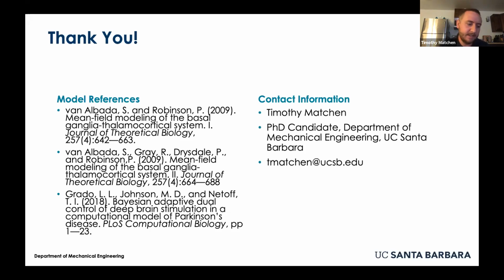So I think one nice thing is the place where things like circadian rhythms can come in and help you is because we're doing this feature extraction rather than using the raw LFP data. If you're using the raw data, like I said before, there's a risk of overfit. Say you're looking at a 24-hour cycle, and you're looking in the first hour, and the only data that you're actually looking at are LFPs that look like the LFPs in that 1 hour time window. But if you're looking at the features instead, one of the advantages is that you can actually learn something about data that you haven't seen yet if it's similar to what you've seen so far.